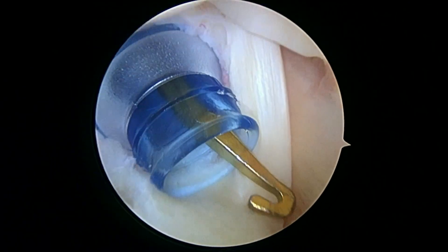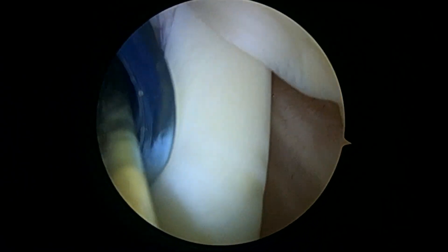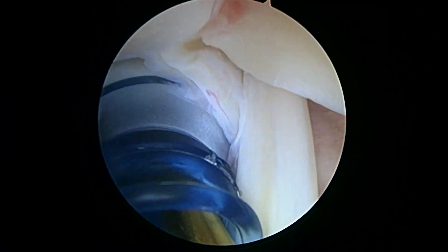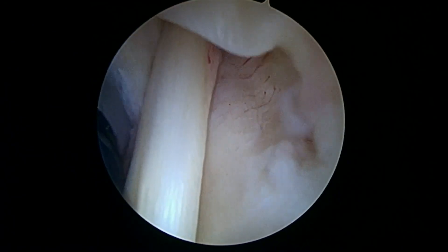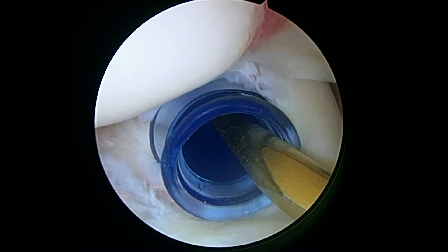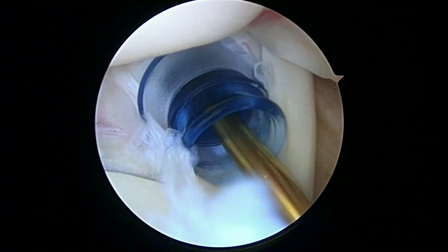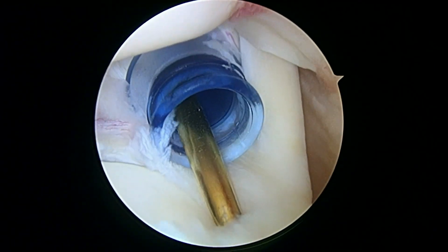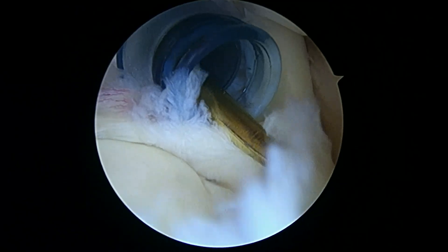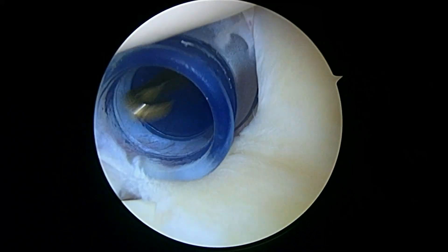The actual tendon itself doesn't look torn — that looks okay. But as we look down at the insertion into the labrum and into the glenoid here, this is loose. See how that's split and torn. So we'll get to work here.